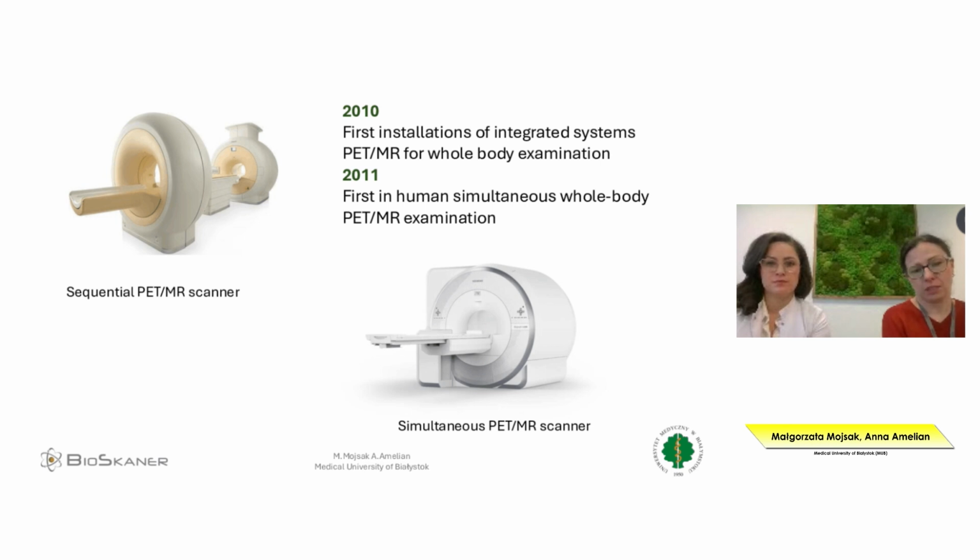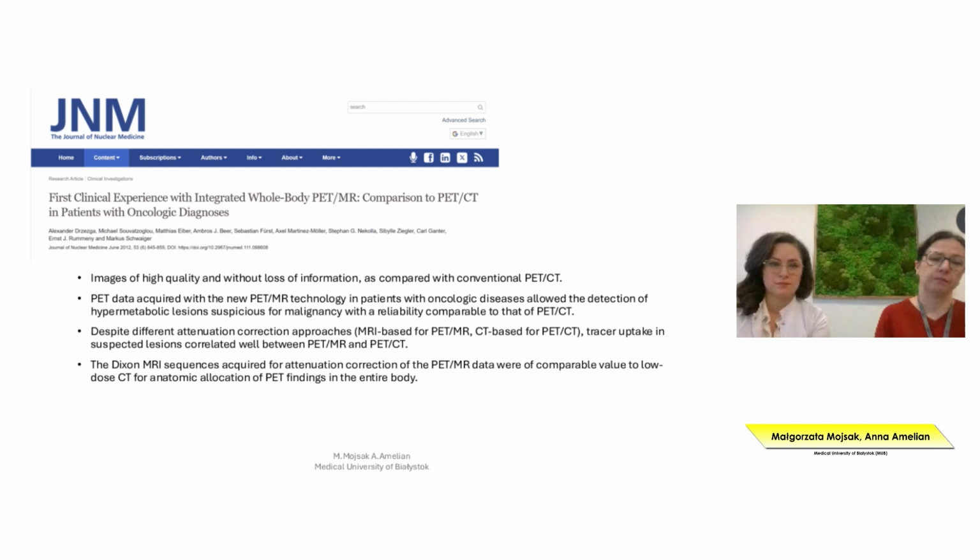And it allowed us to perform the integrated system examination of the whole body, as I mentioned before. But these were the examinations performed with simultaneous PET-MR scanners.